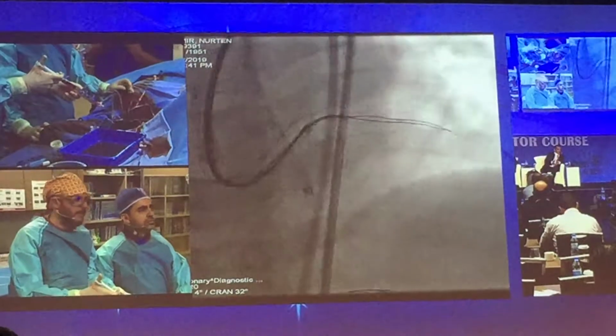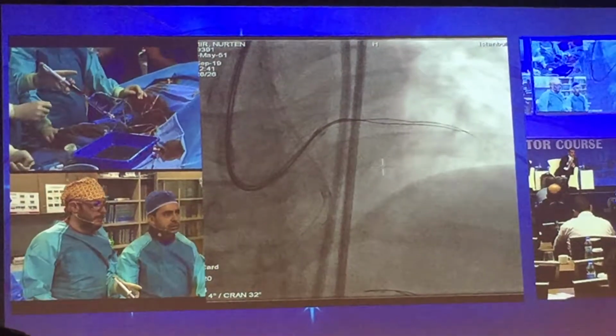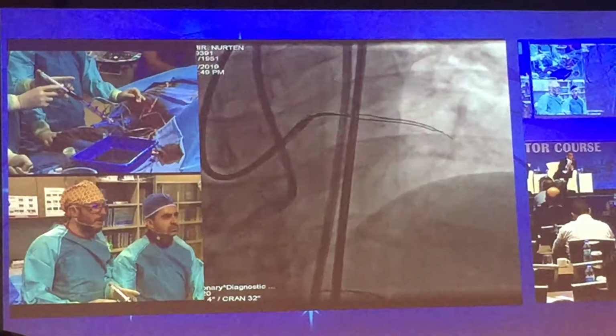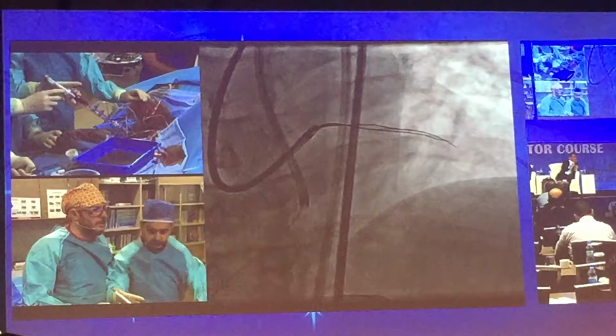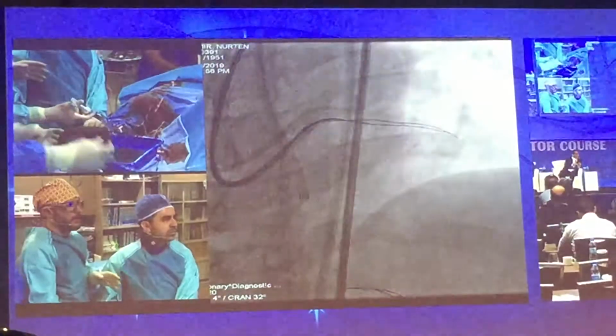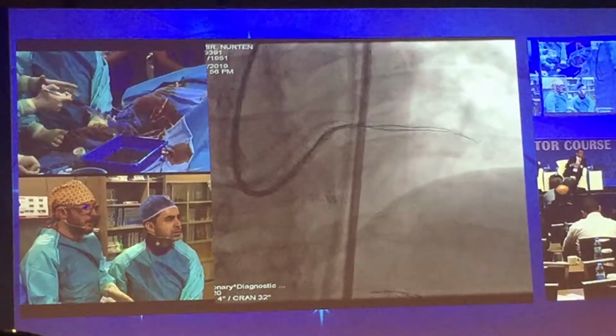Of course, there might also be calcification, and you can see this calcification well with the angiography. So in such a situation, use a penetrating wire to penetrate the proximal cap, and when you are inside the body of the total occlusion, exchange this for the intermediate stiffness wire again. And guide extension therapy is a good option for this. Any comments?